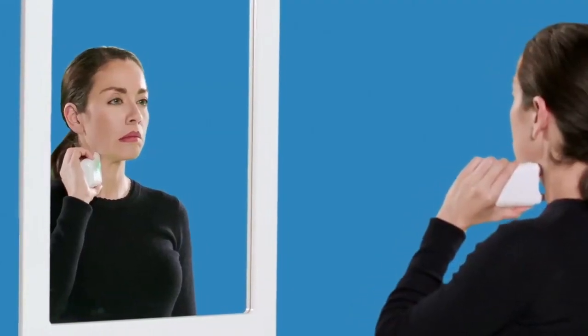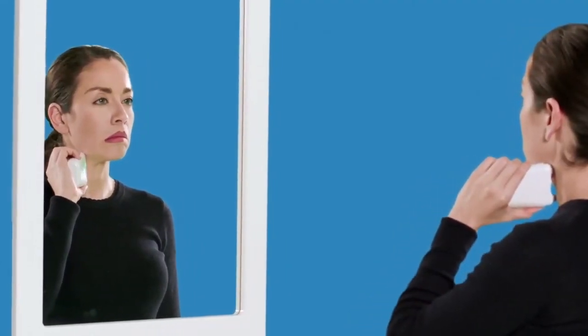Once GammaCore is positioned correctly at the right intensity level, hold it in place until it beeps twice and stops delivering the stimulation. Your intensity level will be displayed at the end of the stimulation and then followed by the number of stimulations and days remaining.